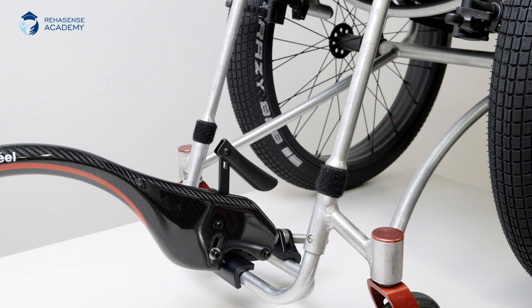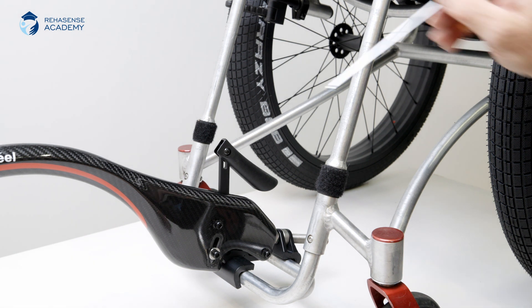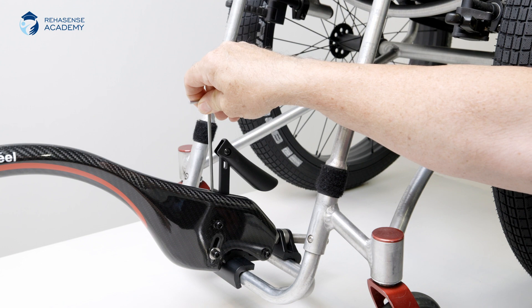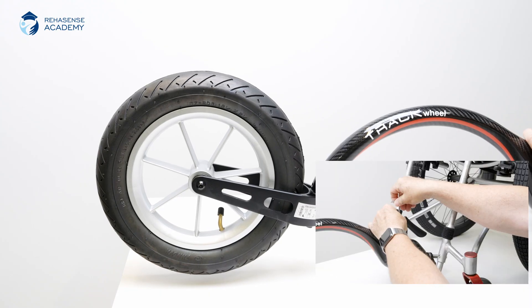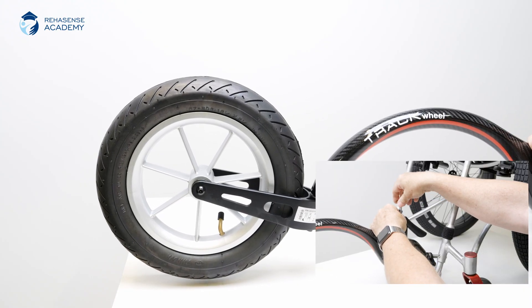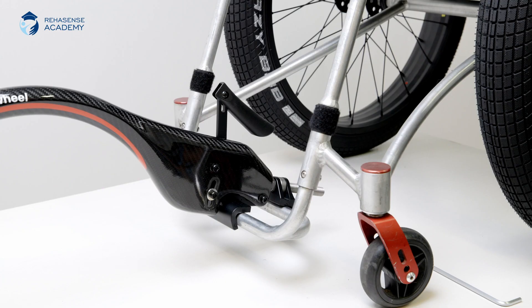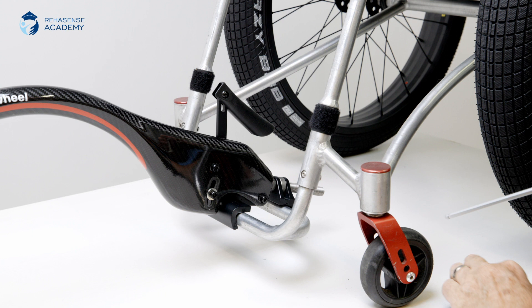Then insert a 4mm Allen key into the screw head inside the top of the track wheel. Turn the screw until the track wheel is positioned on the ground. Tighten the six screws again.